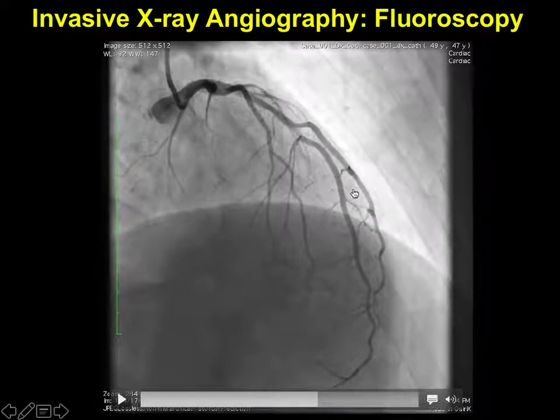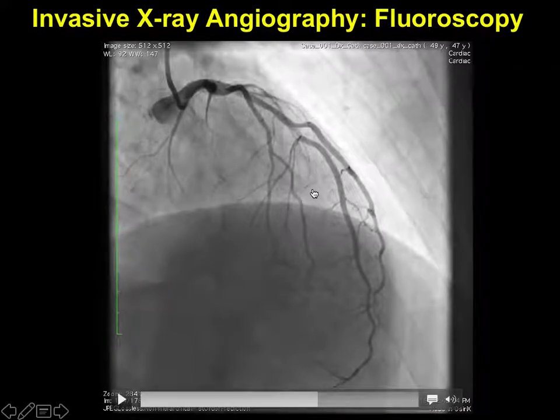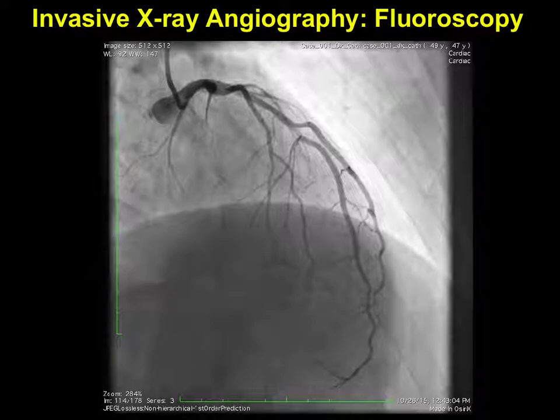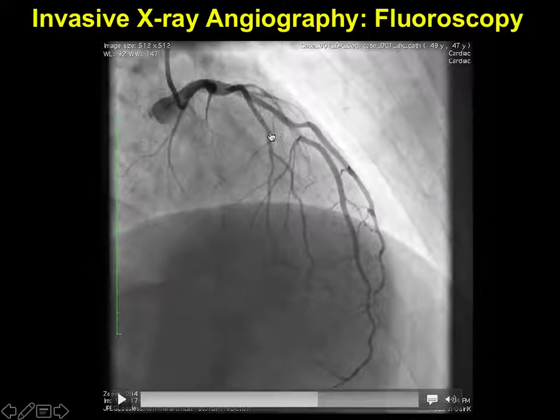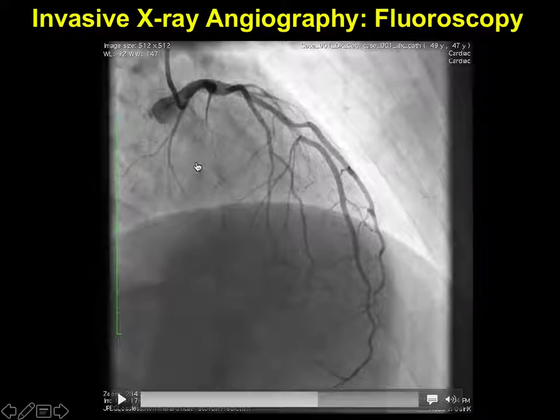It's worth zooming into these images in ImageJ to assess the actual spatial resolution. When you get close and examine a small vessel down to the point-spread-function level of single pixels, you get a feel for what the resolution actually is. For major features of the coronary arteries, this is a great imaging technique.